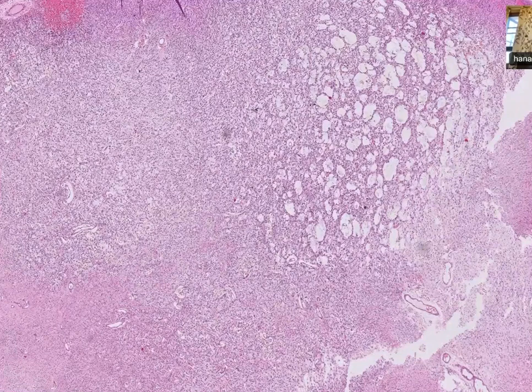Anita, you can describe. Yes, sir. So this is an infiltrating tumor with areas showing microcystic spaces. So can I correct you here? Whenever you're saying an infiltrative tumor, you need to demonstrate the normal parenchyma interface. If you can't show it, you need not say that. Can you see any normal here?